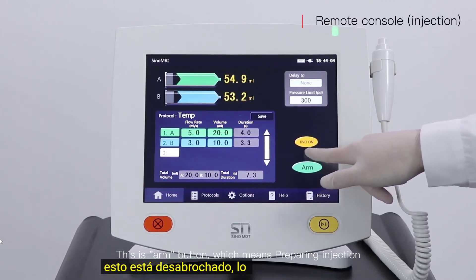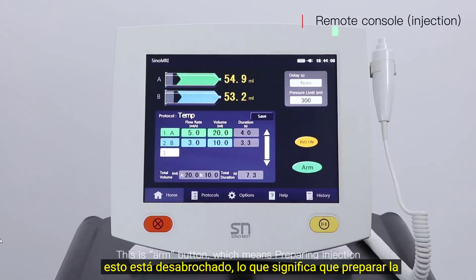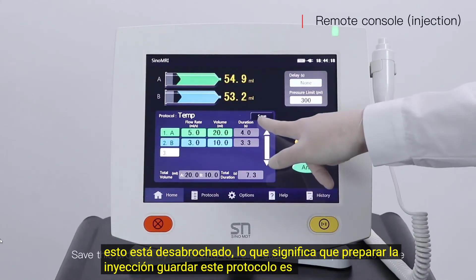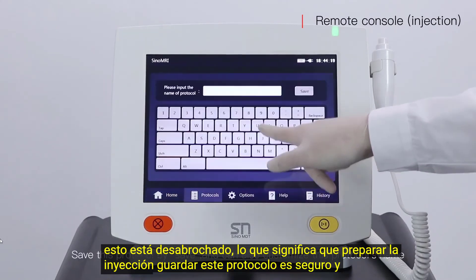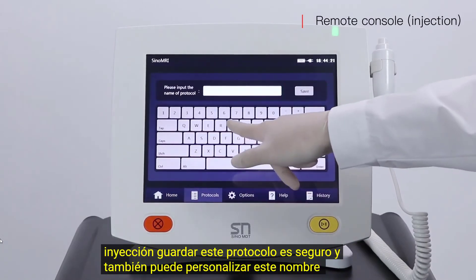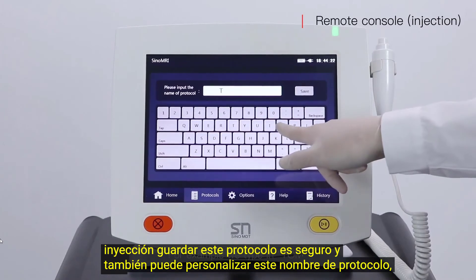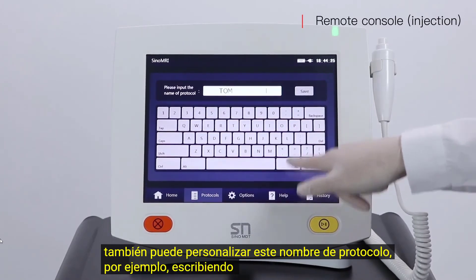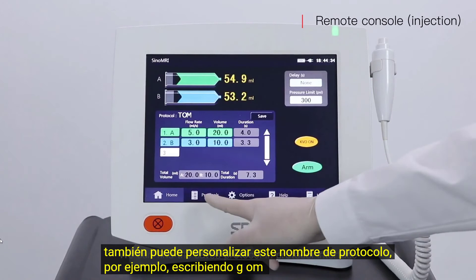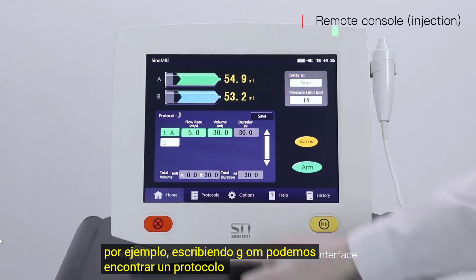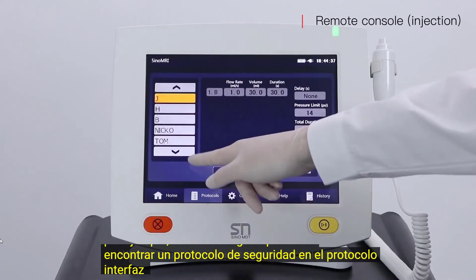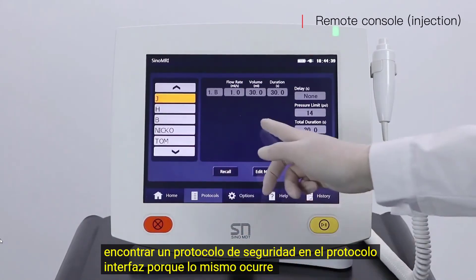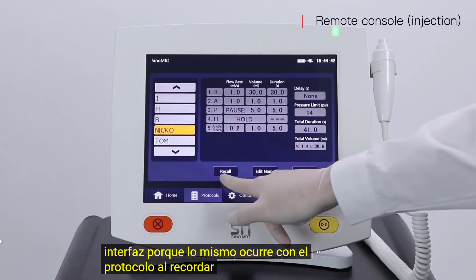This is the arm button, which means preparing for injection. Save this protocol using the save function, and you can also customize the protocol name — for example, type in GOM. You can find saved protocols in the protocol interface and recall a saved protocol using the recall function.